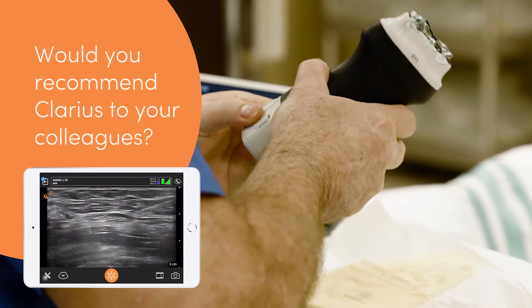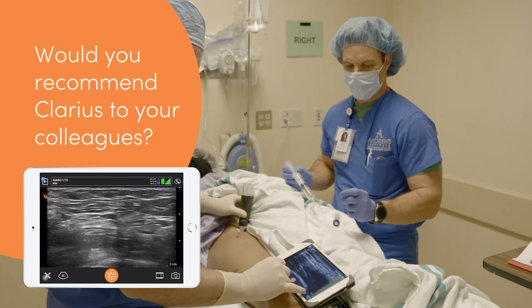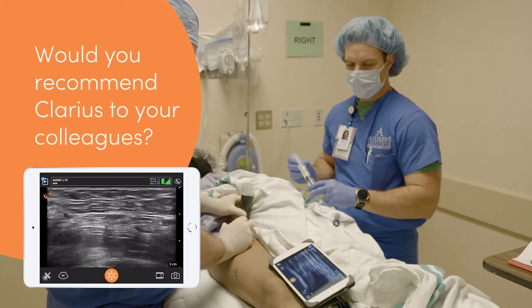For the mobility and the price range, it's very cost-effective and you can utilize it for a lot of things. I would highly recommend it to somebody in a busy practice who needs to move around — which almost all of us do. I'd highly recommend getting their hands on one to have that ability to be mobile. I just grab the iPad in one hand and the probe in the other hand and off I go. That works great for me.